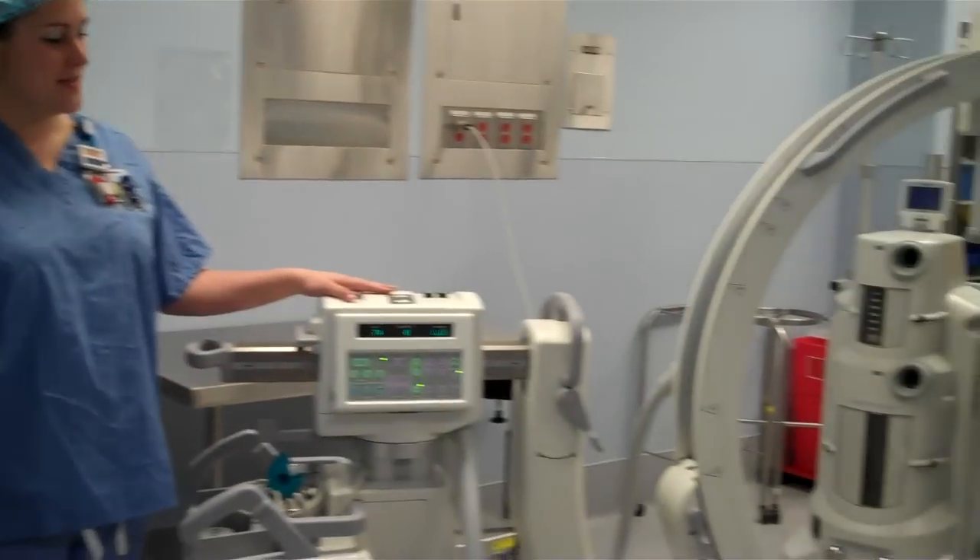Hi there, I'm Maria. I'm going to be demonstrating the locks of the C-arm and the function of each one.